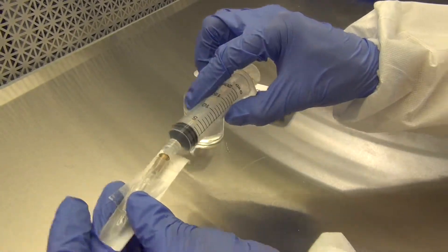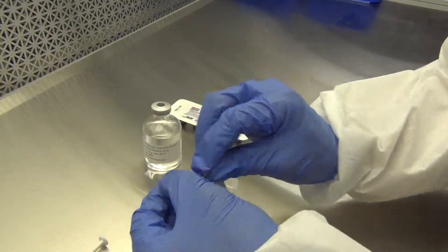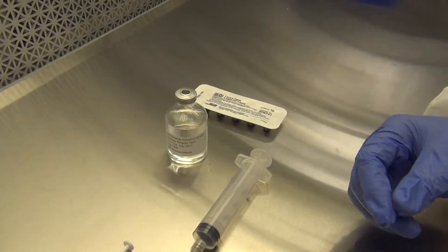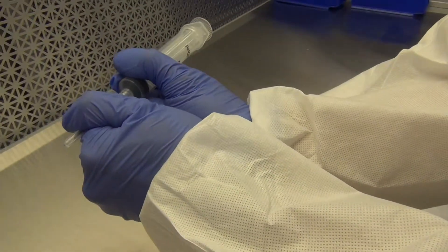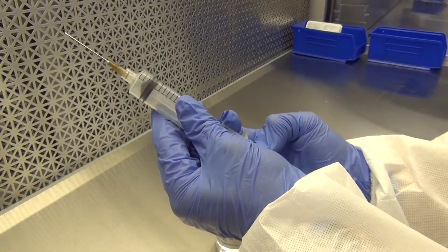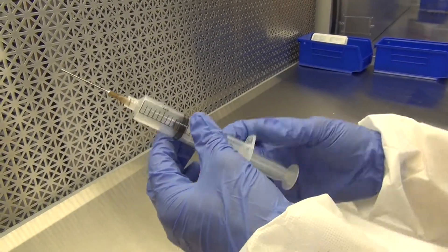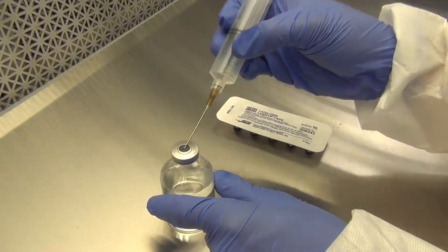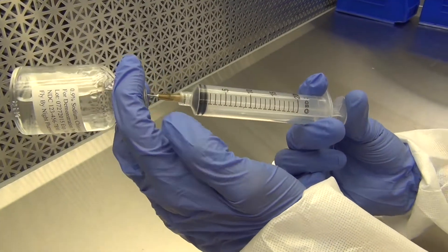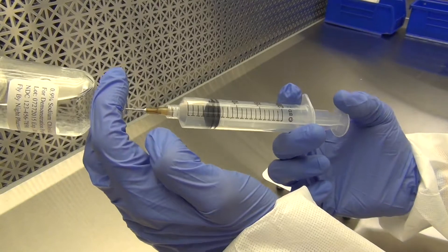Affix the second 20 milliliter syringe to a sterile needle. Use an alcohol wipe to swab the top of the sodium chloride vial. Withdraw an amount of air equal to the amount of sodium chloride that you are going to withdraw from the vial. Use the anti-coring technique to push the needle into the sodium chloride vial. Push the air in. And withdraw the amount of sodium chloride needed for the second dilution.